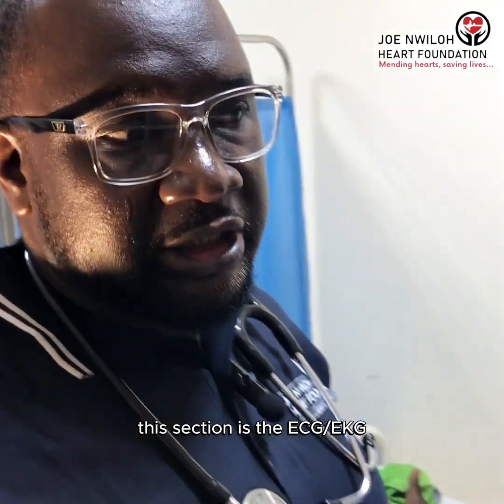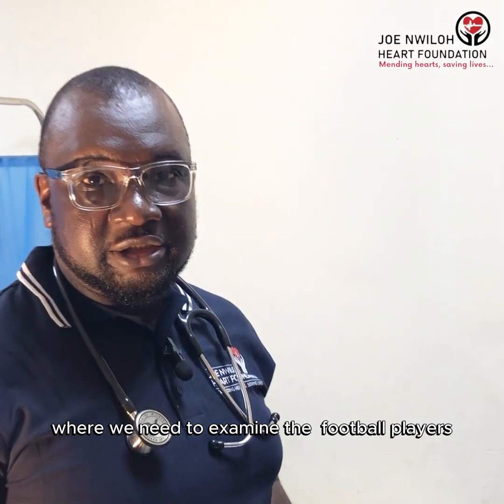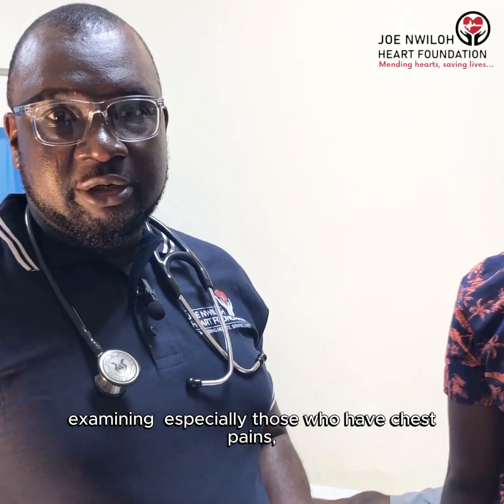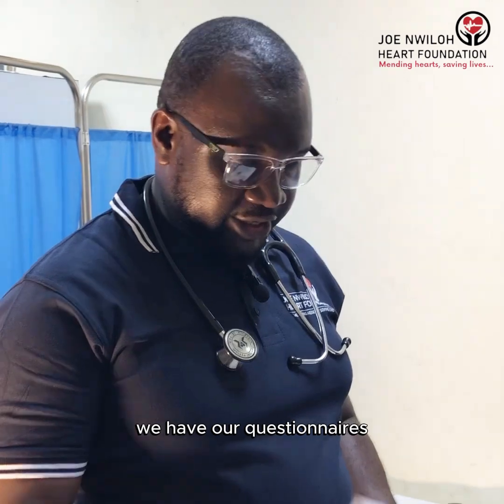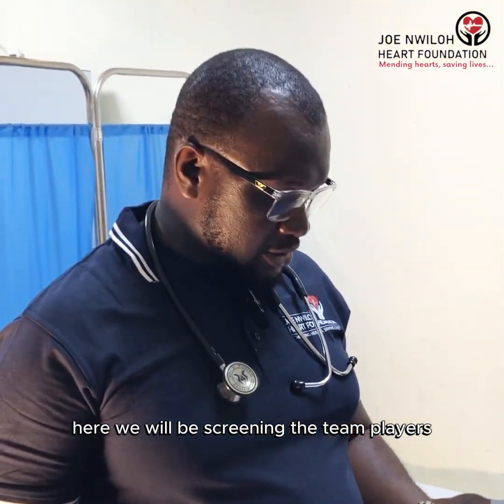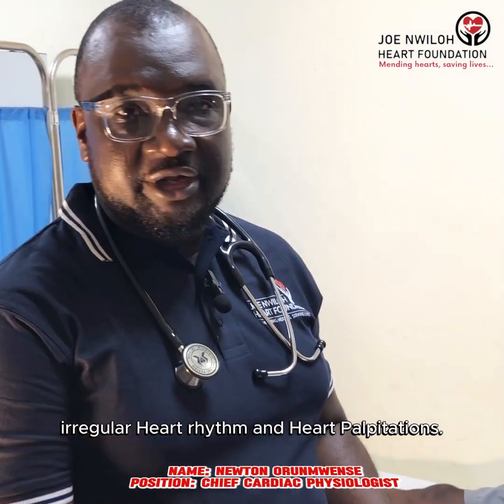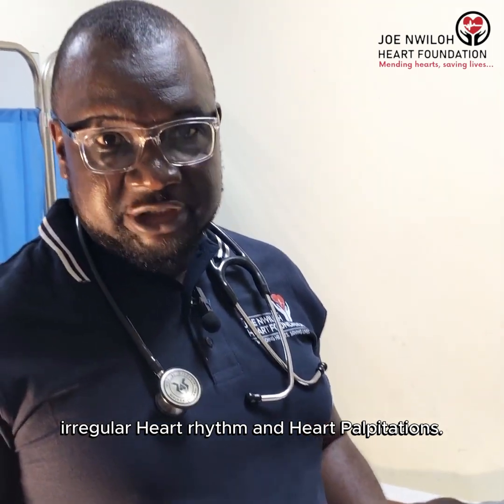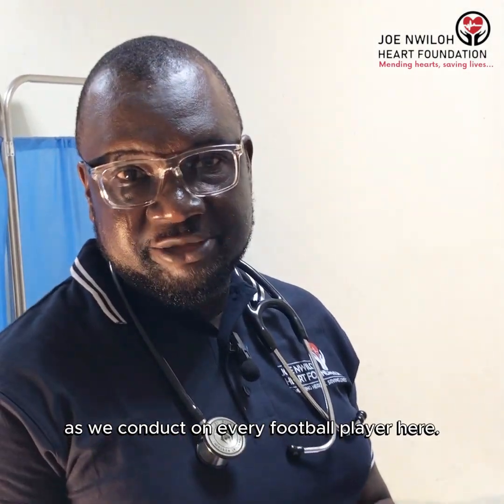So this section is the ECG section, EKG section, where we need to examine the football team. We are here in Bayelsa to examine their football team, especially those who have chest pain. And we have our questionnaire here, where we'll be screening those team players on whether they have high blood pressure, murmur, irregular heart rhythm and palpitation. So the questionnaire carries a lot of tests, examination we conduct on every team player here.